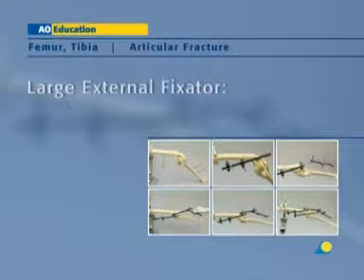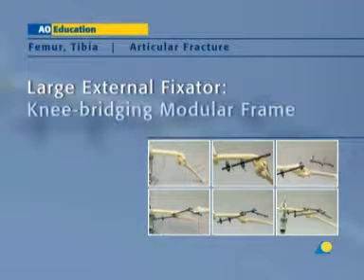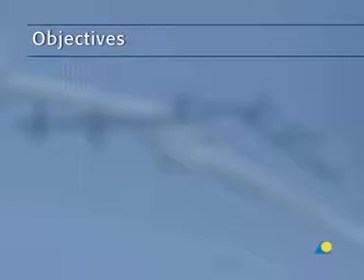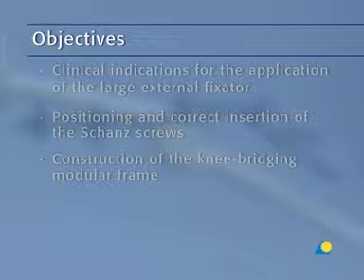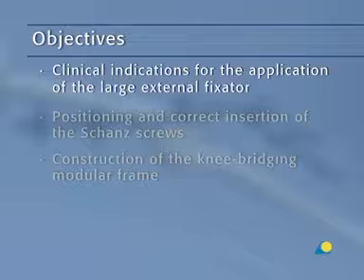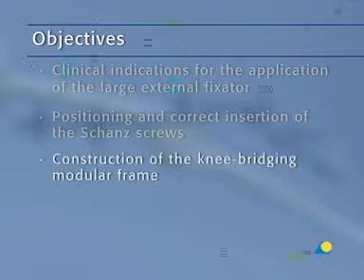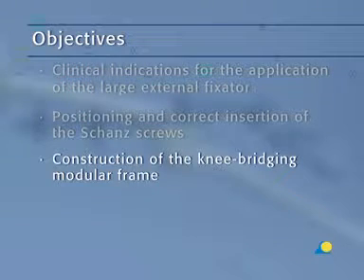In this presentation, an intra-articular fracture about the knee will be reduced and stabilized using the large external fixator in a knee bridging modular frame. The objectives of the exercise are to understand the clinical indications for the application of a large external fixator, the positioning and correct insertion of the Schanz screws, and the construction of the knee bridging modular frame.